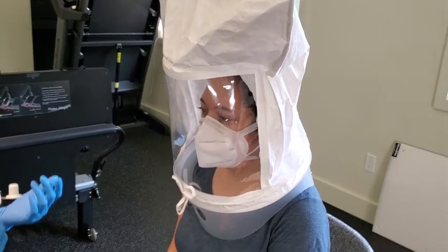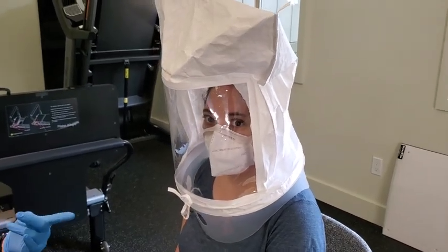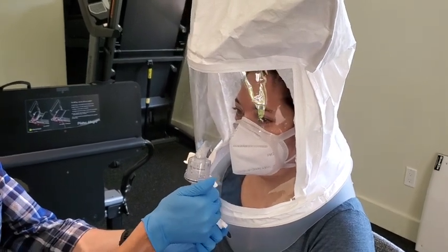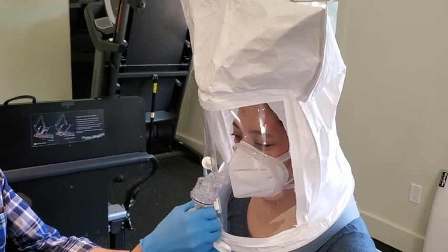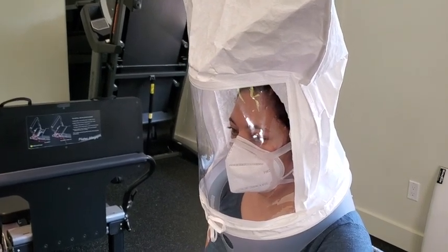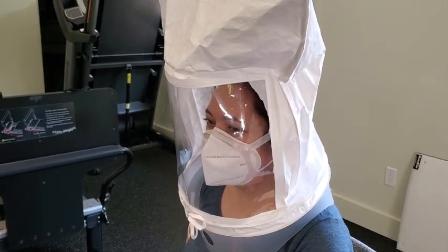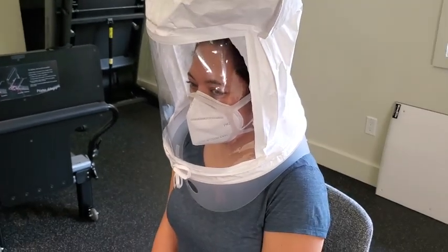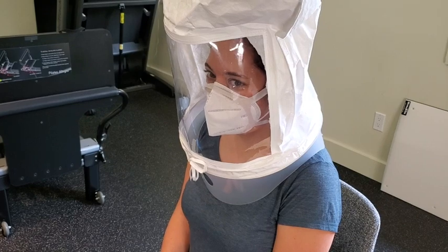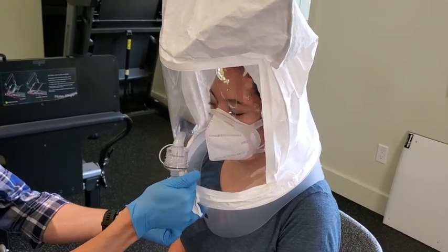Okay. So now we're going to do the same thing. So the first one was normal breathing. Second one is deep breathing. Is that what you just did? Oh, yes. Okay. So now, deep breathing. Hold on with my cheat sheet. Good shoulder action too. Simulate deep breathing. This is the lady that you want doing the deep breathing. Okay, good. Now it's going to be side to side. You can start now and do this.